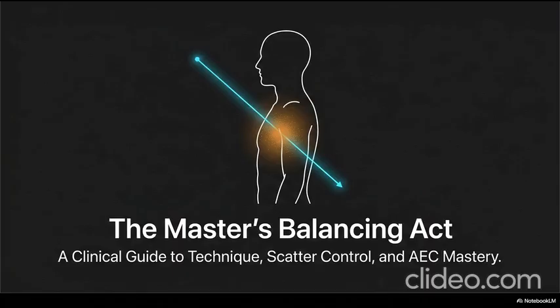The numbers. Exactly. The numerical data the computer spits out indicating the actual dose that hit the plate. They have to rely on their technique charts and their foundational knowledge of physics. Because while AEC and digital software reduce the number of repeated X-rays when used correctly, they can silently, continuously increase patient dose if misused.